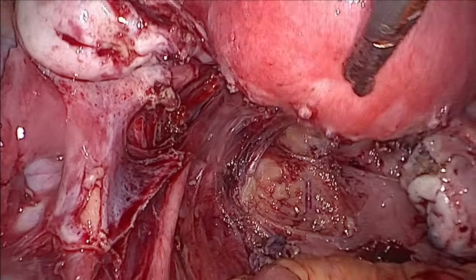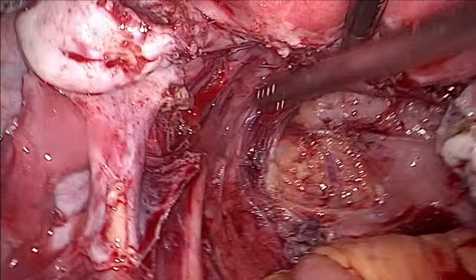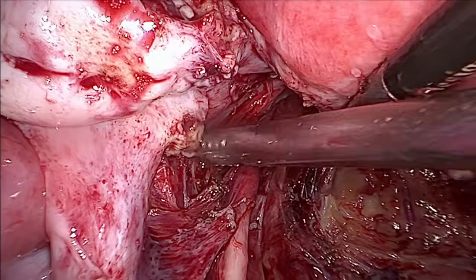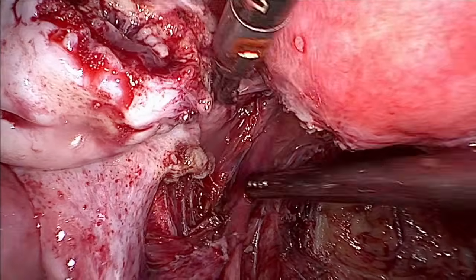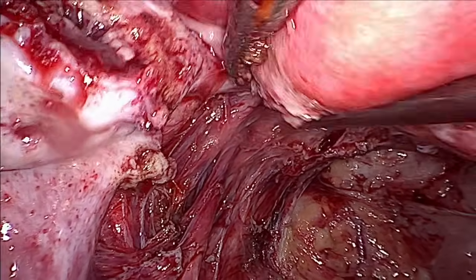Give me a suction. Whenever you are coagulating near the ureter, especially when you are using the shears, just keep one instrument. Yes, now I know where it is.